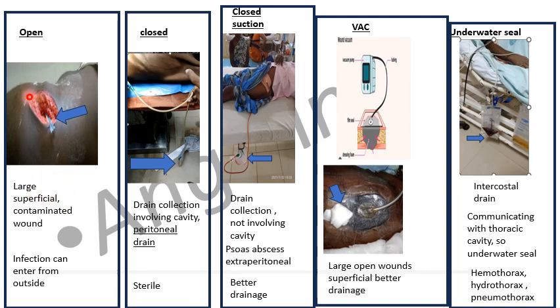This was a road traffic accident, a very bad wound, with a lot of contamination. You keep a drain, whatever infective material gathers at the depth will come out and it will allow healing. Now, the disadvantage is if this open drain is kept inside a cavity, it will take the infection from outside also.